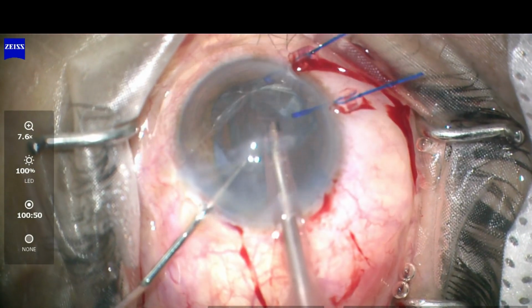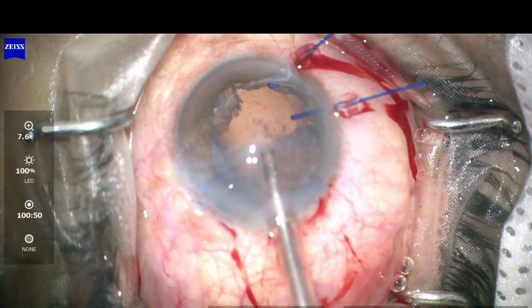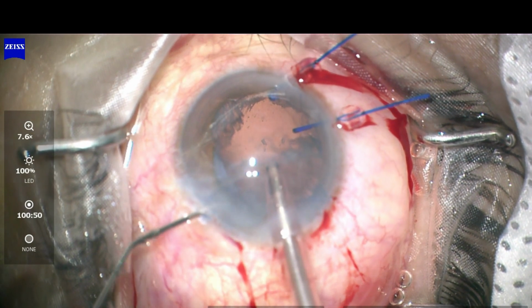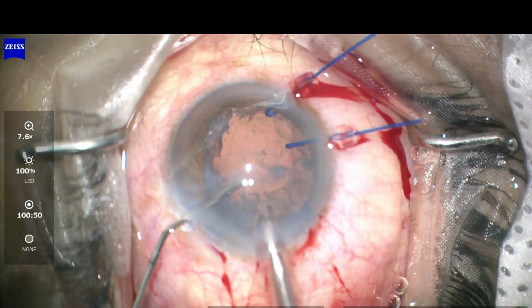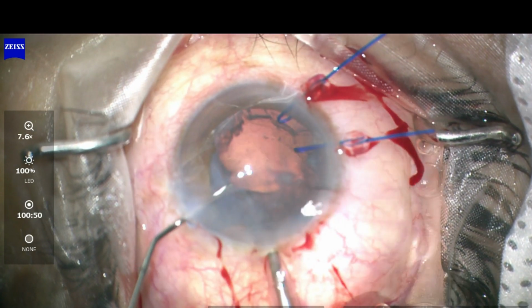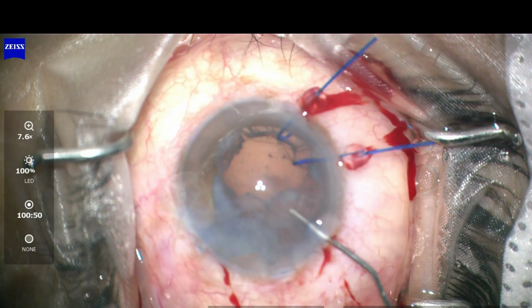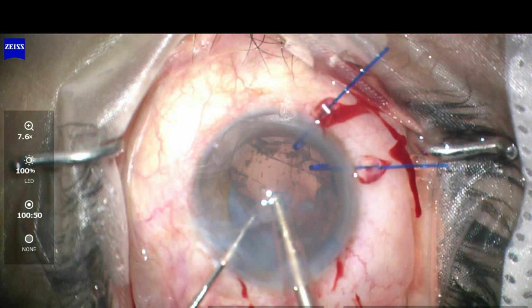Once the pieces are removed, before taking out the phaco probe, make sure that the anterior chamber is formed with a viscoelastic substance to prevent further increase in the subluxation. So make sure whenever you come out, the anterior chamber has to be formed. Now it is clearly visible that there is a nasal 2 to 3 clock hours of subluxation.